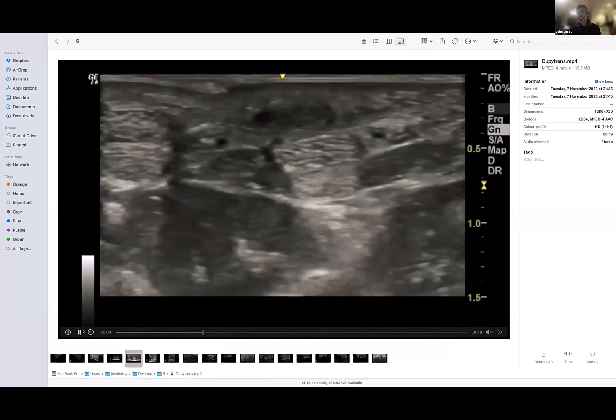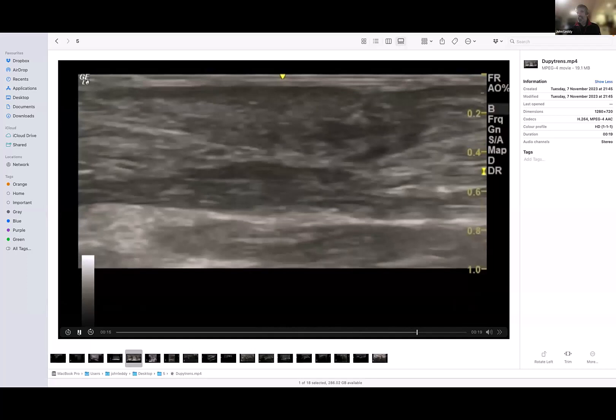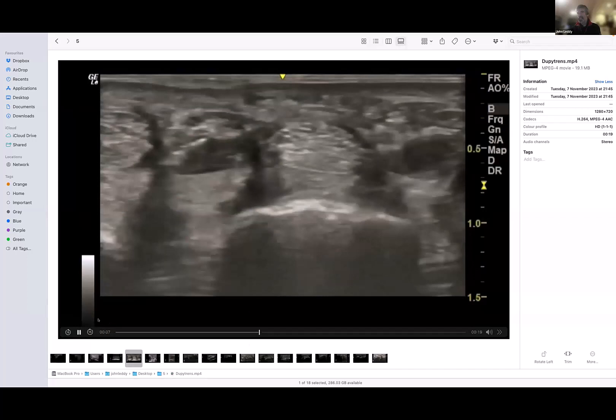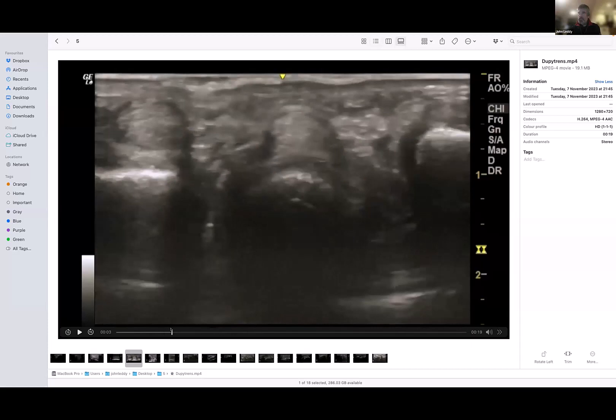Do you know what this is? It looks like the dorsal foot or the palmar hand. This is Dupuytren's. What we're looking at is this here — I'll slow it down. This is the palm, these are the flexor tendons, and this is the nodule — the little plaque-like thing. As you go through it, that plaque blends with the skin. Can you see the line of the skin is pinched? So the surface of the skin is pinched, which means there is contracture within the skin fascia.